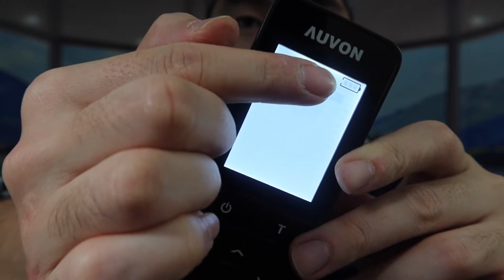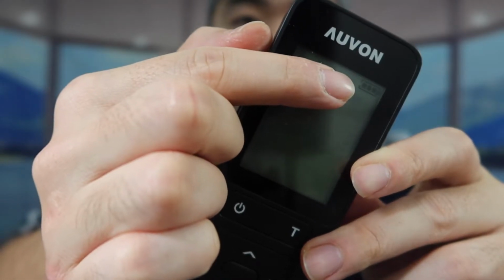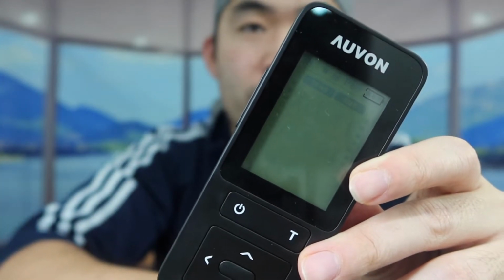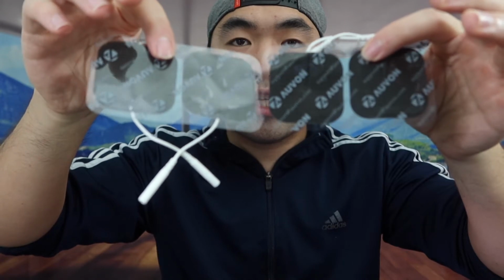So that is how you guys know when it's actually charging right here. So I'm assuming once it's fully charged, all the lights will stay on. But now I'm going to plug in the cable to show you guys how to use it first. So for this test, I'm going to use the square one right here.